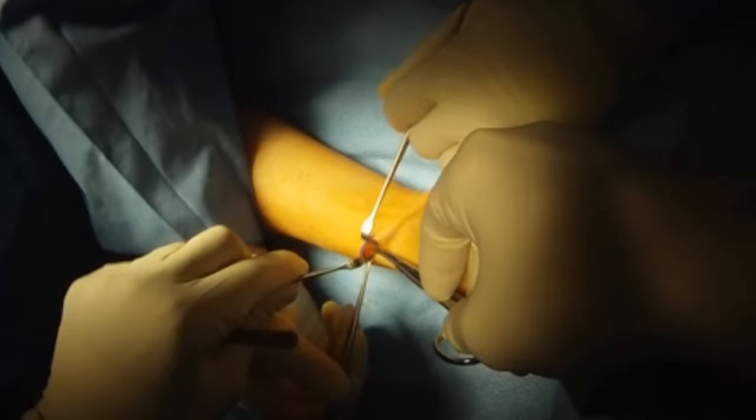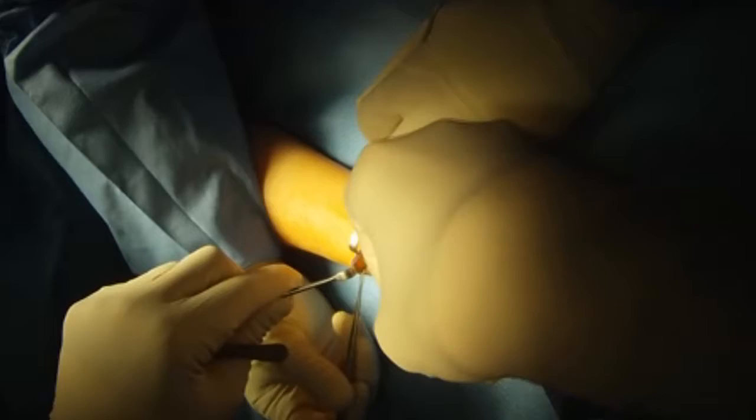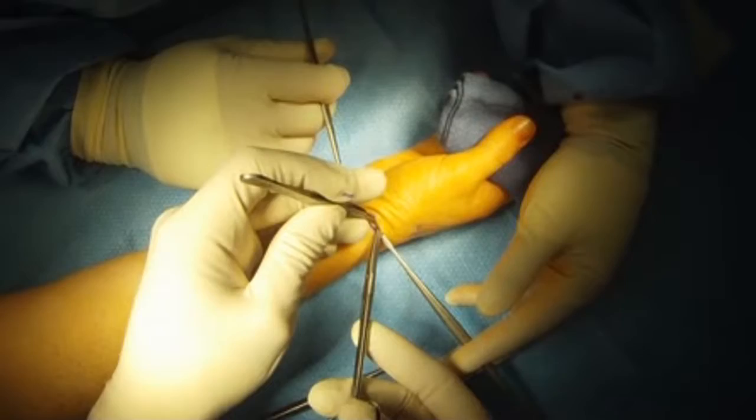Then I use a small beaver blade to incise the sheath. I then cut or release the sheath going up the arm, then down towards the thumb.